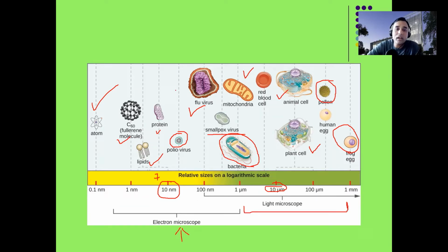So how and why is it important to protect yourself from these bacteria? Because anything, even foreign particles, any bacteria, fungi, viruses, you don't want them in the media, because the media is rich. It is rich in nutrients. It has rich conditions. It has light. It has water. It has everything that these bacteria or microorganisms require. So basically, they will grow happily. So if they grow in the media, what will happen? They will eat your plant and they will kill the plant.